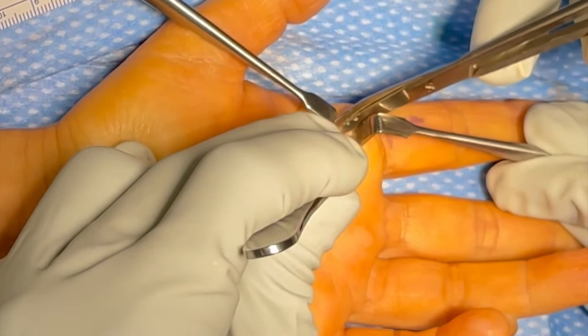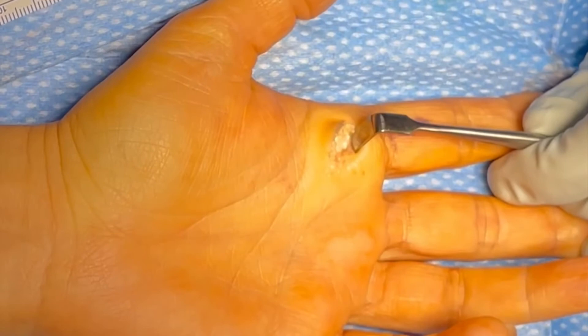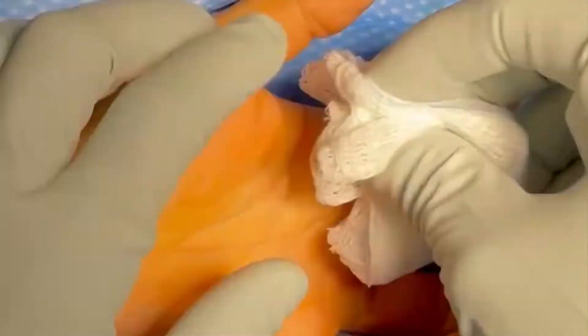At this point in the surgery we've removed the A1 pulley or part of it to prevent recurrence of the mass. Now we're going to inject Ropivacaine at 0.5% — brand name Naropin — which is a long-acting local anesthetic that should last anywhere between 6 to 12 hours, giving the patient good post-operative analgesia.